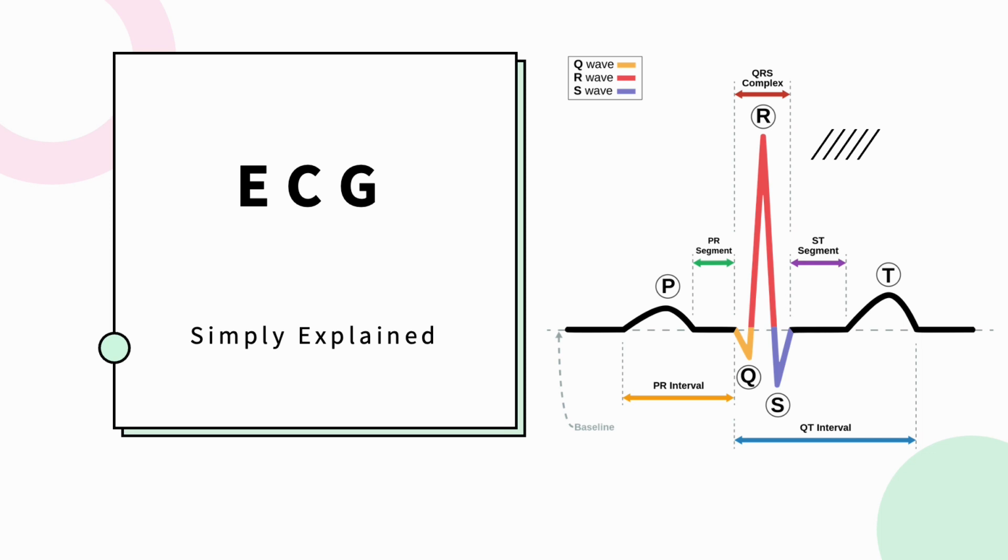So in this video I'm gonna give you a really simple basic understanding of the EKG and how to read every part of it. So let's get started.